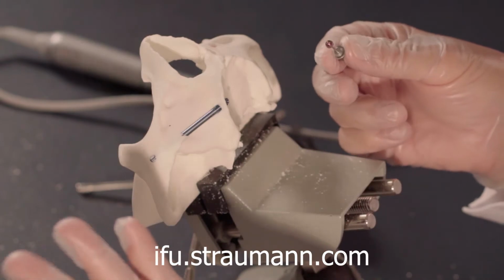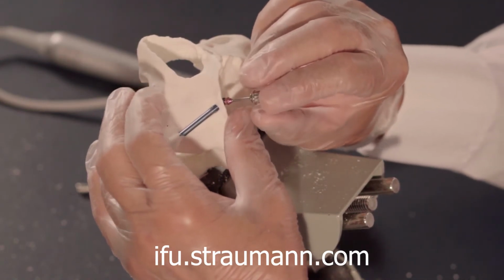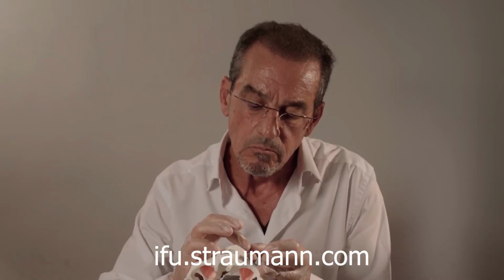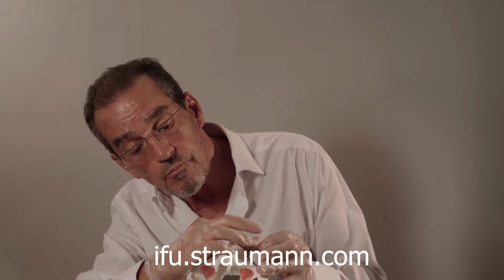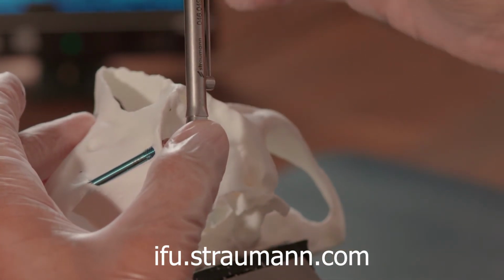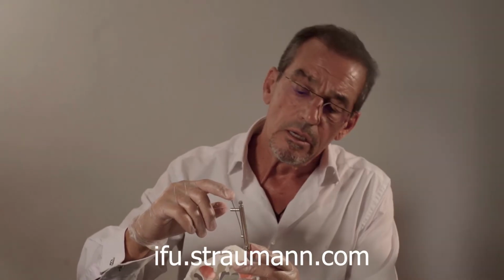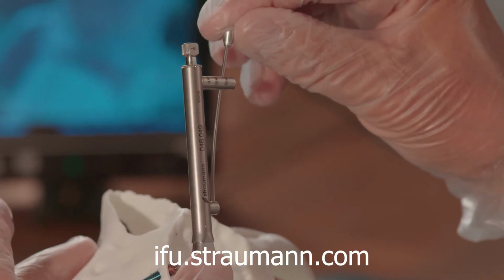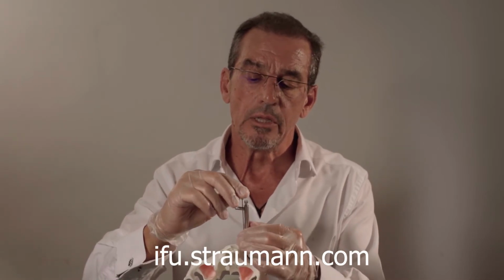We are going to use the typical Straumann screwdriver. So now it's in place. So now we have the wrench in place, and since the initial torque was even more than 50, we are going to use 35 newtons in order to secure this abutment, and that's all.